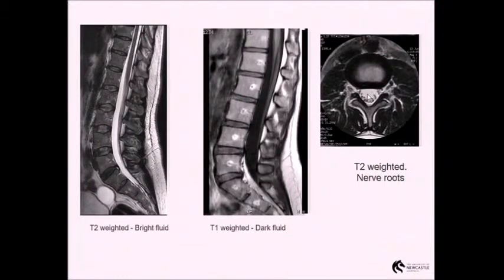our CSF, and now this is quite low down in the spine. We're down past conus medullaris and we're seeing individual nerve roots associated with the cauda equina. And we can see important muscle groups, spinous processes, transverse processes.